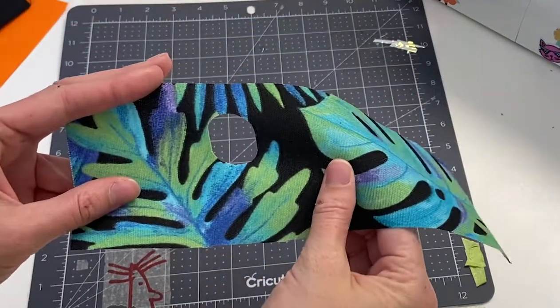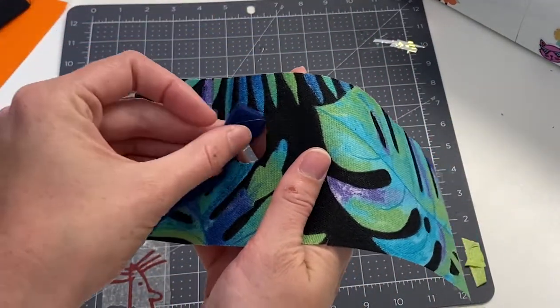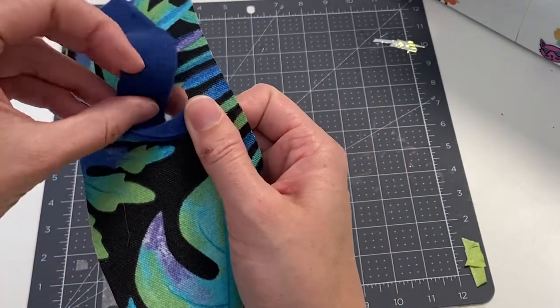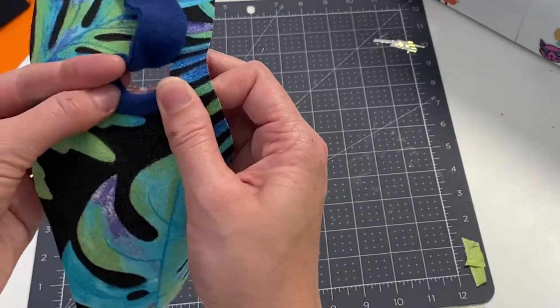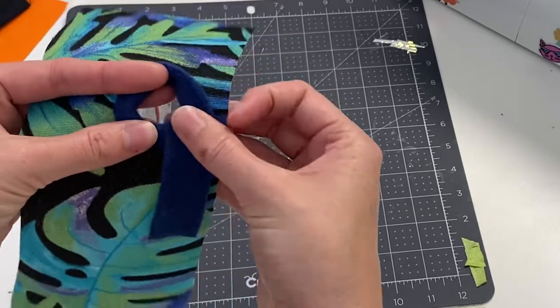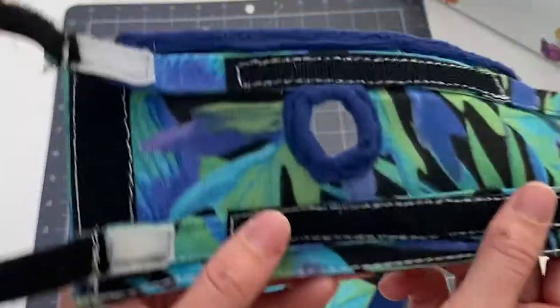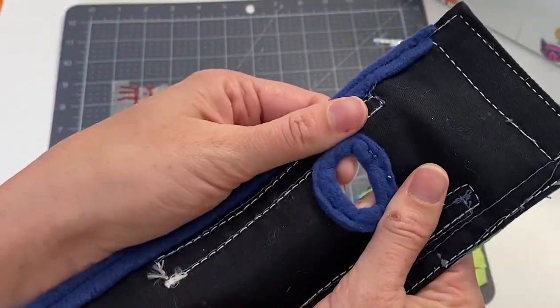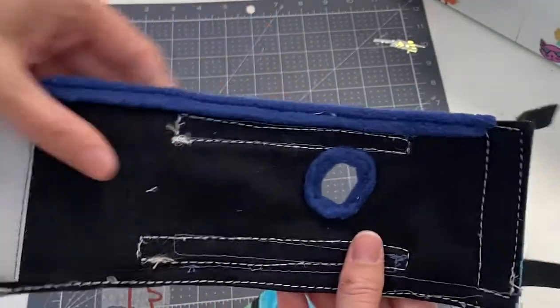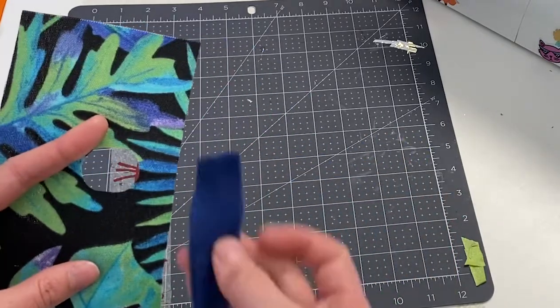I'm not worried about seam allowance here because I'm going to wrap the edge in fleece. Once the hole is cut out, I take a strip of fleece about 5 inches long and wrap the inside edge of the hole. I hand-stitch it on there because it's a lot easier than trying to get it through the sewing machine. This is how the sling looks once it's stitched. I also added fleece to the top edge of the brace to help protect Molly's skin where she might be bending over the edge.